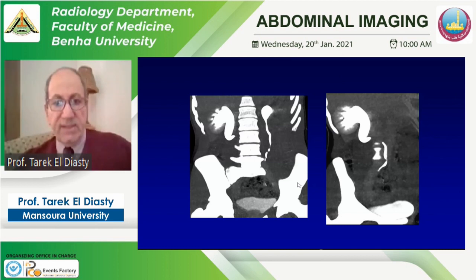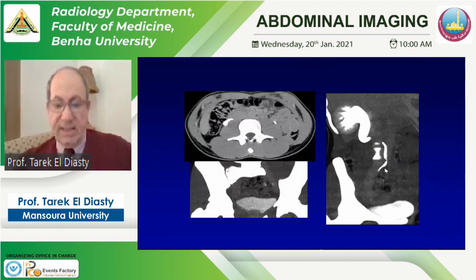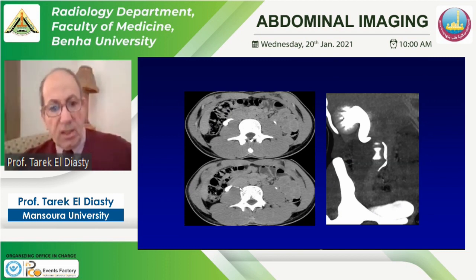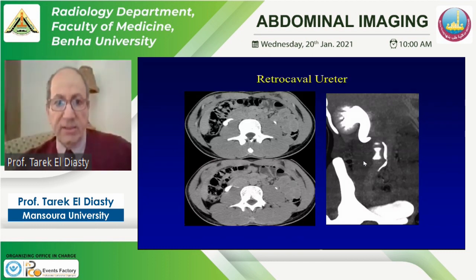This is an example of CT urography — a scan in the excretory phase, after approximately five to seven minutes. We can see the course of the right ureter. On the axial images in the delayed excretory phase, we can identify the aorta and the inferior vena cava, showing that this ureter has a retrocaval course — a case of retrocaval ureter. No early scan is needed; we can diagnose it on this excretory scan alone.